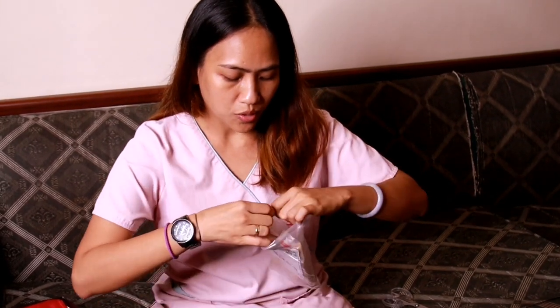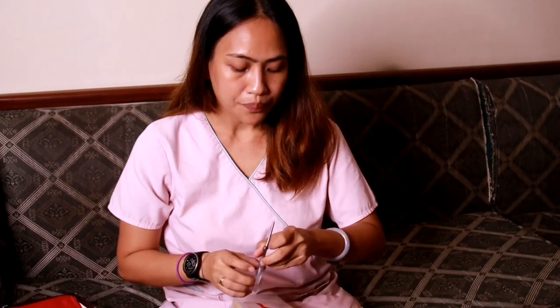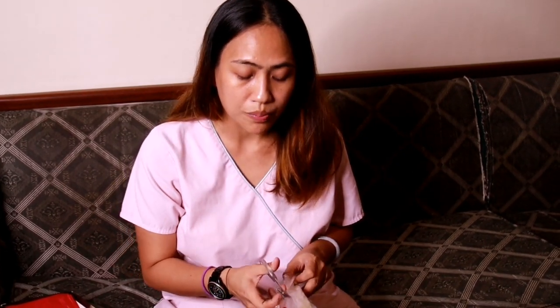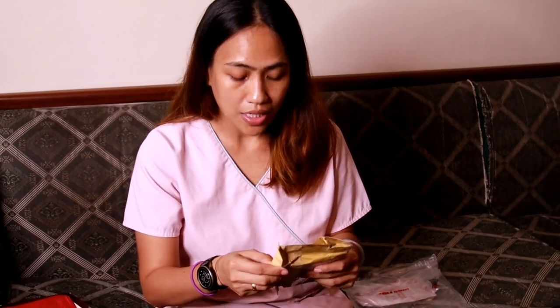Mostly what you can find on online platforms is the pediatric version, and the adult one is commonly sold out. Fortunately, Shopee now also accommodates international suppliers aside from China, so this came from Jakarta, Indonesia, and the price is cheaper than what's locally available.